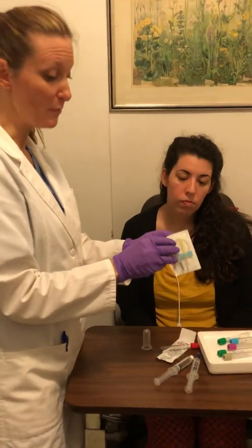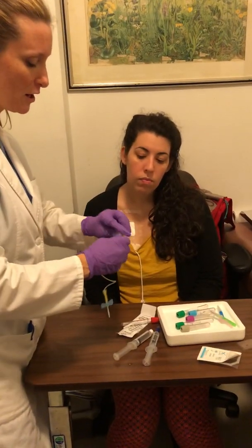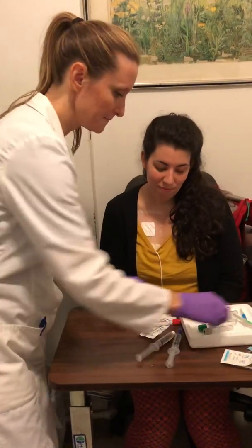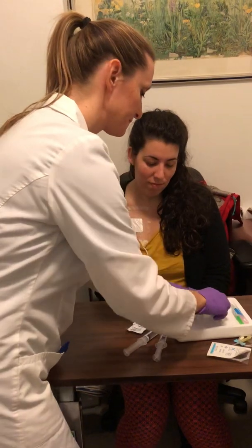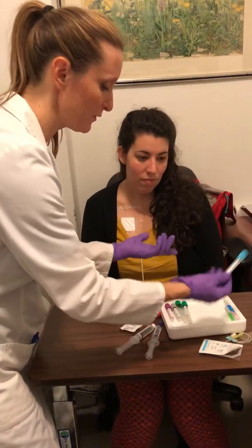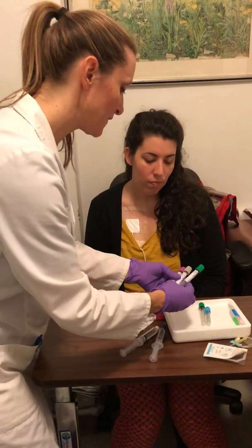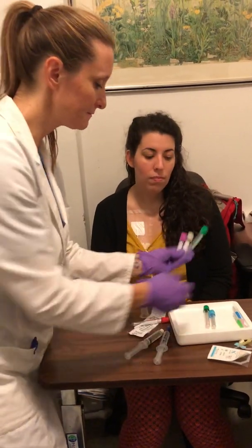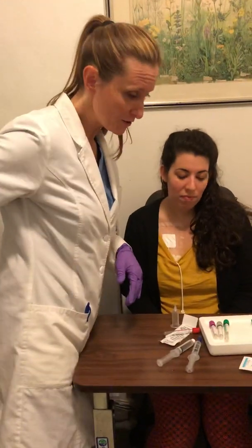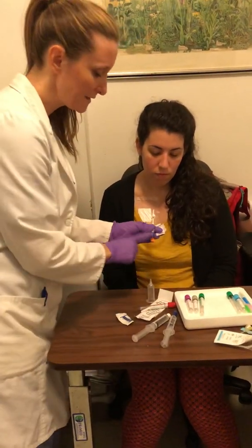You can always use a butterfly — attach a butterfly to your hub like usual, then take that off and now you have a needle. Depending on what tubes you need: you have your lavender for CBCs and other regular tubes; if you're doing an anticoagulant panel you need your blue, and so on. For most draws you're going to be doing one of each of these — liver functions, kidney functions — to make sure the patient isn't having any problems.